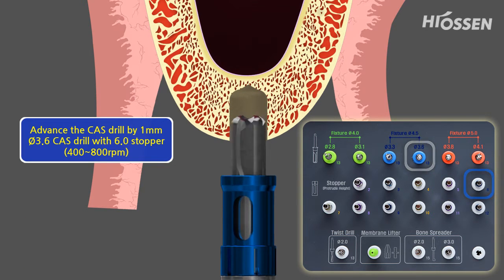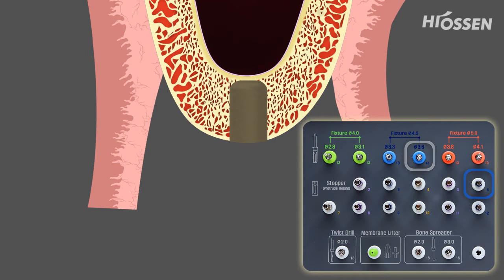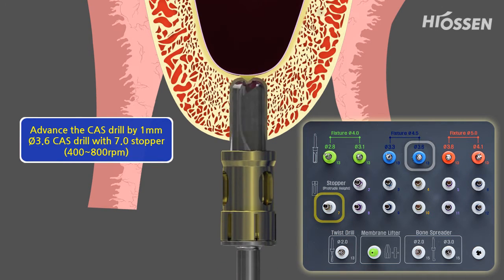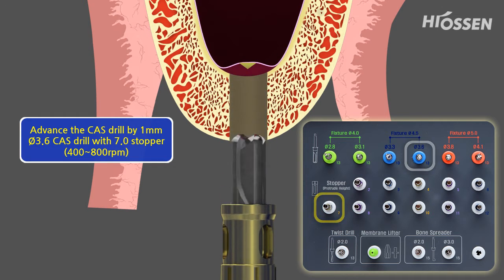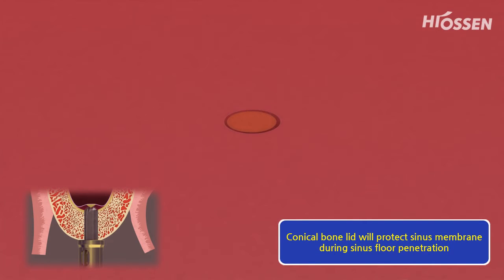The drilling hole is being enlarged with a 3.6 diameter COS drill and a 5 mm stopper. Afterwards, the drilling hole is being extended and deepened by using the other COS drills and stoppers until the sinus floor is reached. In the displayed case, the last step is to use the 7 mm stopper, whereas the conical bone lid elevates the membrane of the sinus floor. Due to the COS drill's unique design, a conical bone lid is being formed and the direct contact with the membrane is being minimized.